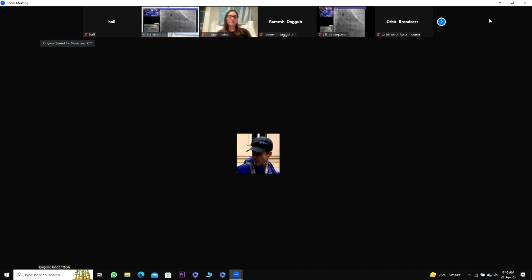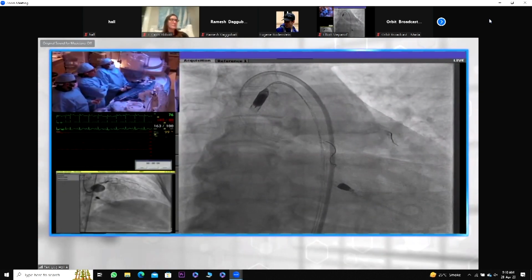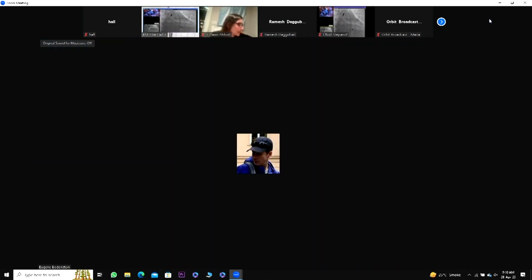Which wire is being used for recrossing? This is a Runthrough. You can just take it down if you want. Yeah, it's fine. Good. Yeah, press 3 up. 3.5, we'll take that.